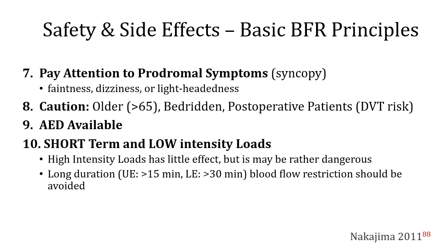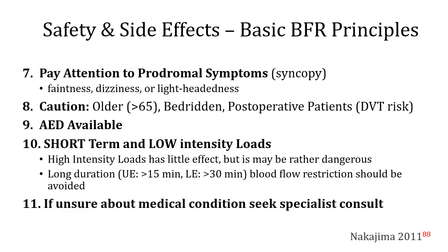That 15 minutes is a bit conservative. You could go up to 20, particularly with upper extremity ergometry, such as with an arm bike, which would usually be okay, but then you want to deflate thereafter. If unsure about medical conditions, make sure that you seek specialist consultation, and working alongside a collaborative care team with a multidisciplinary approach is going to be ideal.